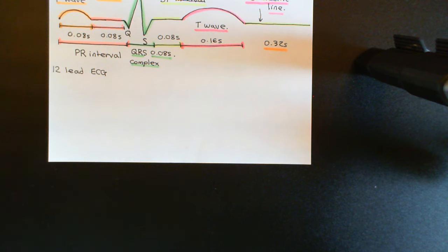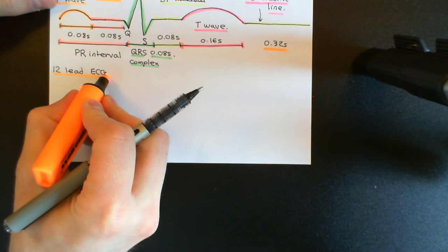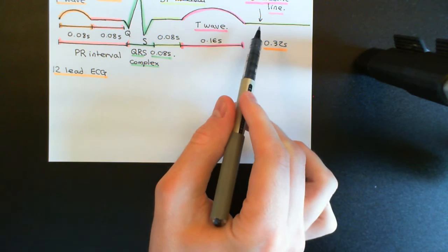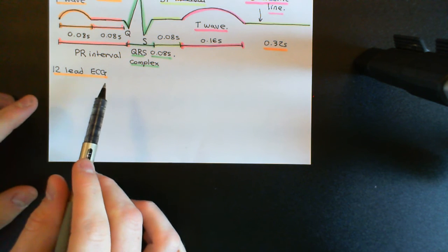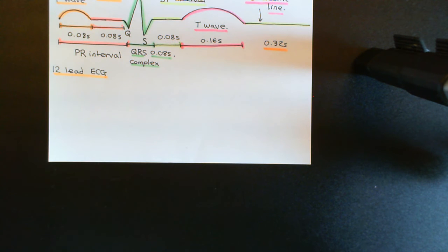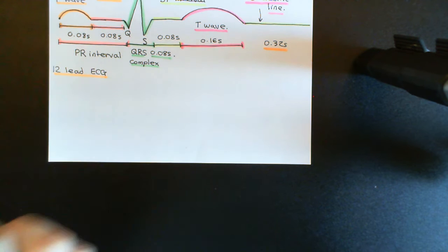But in fact, what we're doing with a 12-lead ECG is we're actually just doing 12 separate ECGs. We get 12 different pictures that will all show a pattern very much related to this, but slight variants of this. And we're just going to be measuring electrical potential difference between different points on the body. We chose, when we generated this one, to pick the right arm and the left leg, and that's a brilliant one to pick because it's beautifully in line with the directions that the cardiac vectors are actually going, so you get a beautiful ECG trace like this.